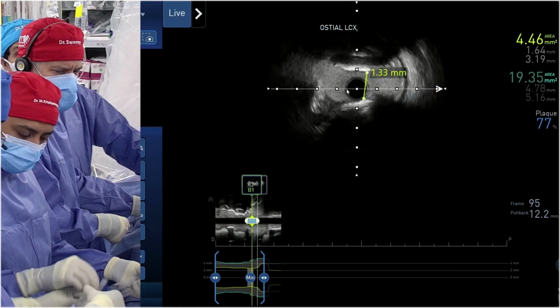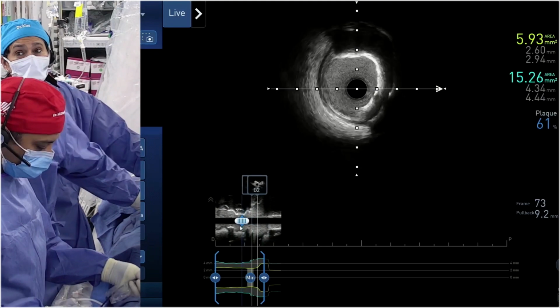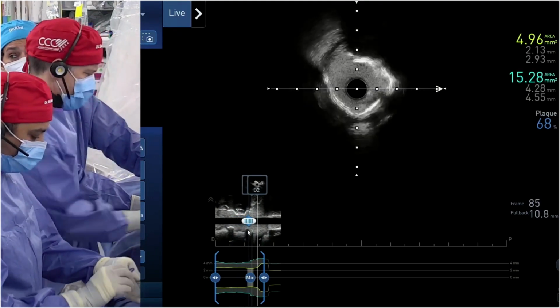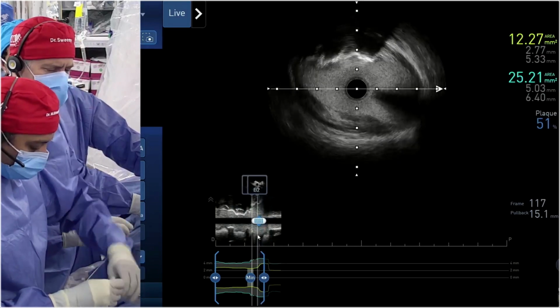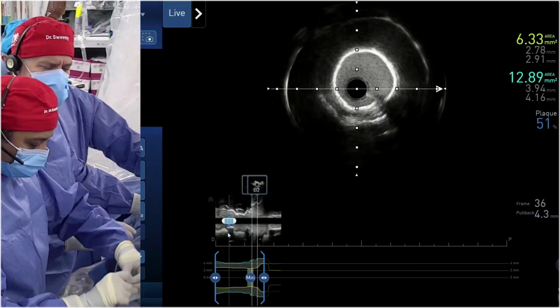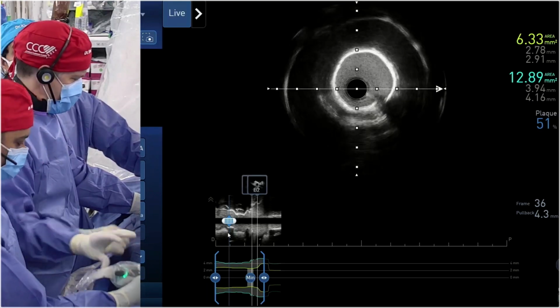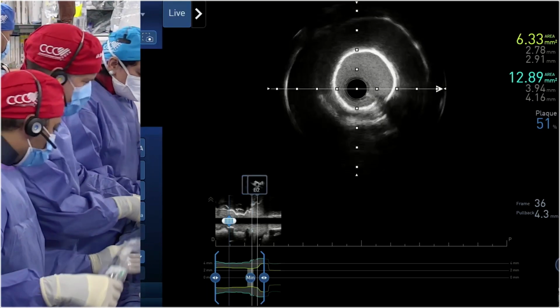Yeah. So you see, actually it's not one, you have nodule from both sides. And that's one thing. Another thing is the calcium plate around is not a lot. So in this condition, I think you could do anything. But if you have thick circumferential calcium around, then you will have to do either rotational atherectomy or orbital atherectomy, and then maybe IVL after that to take care of the nodule.